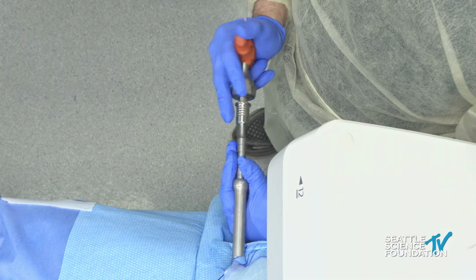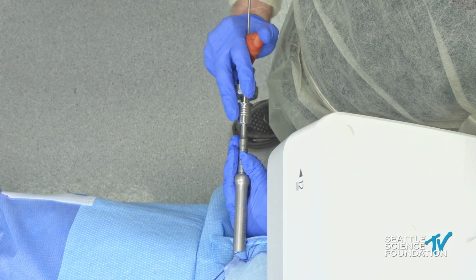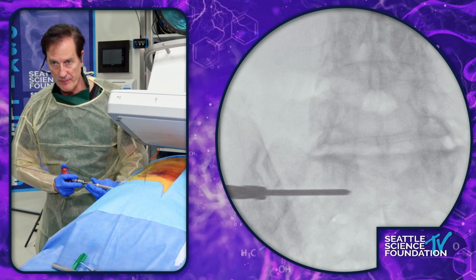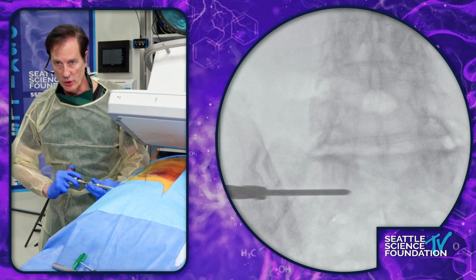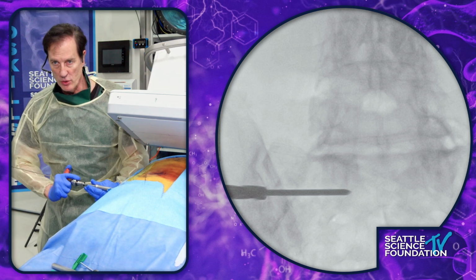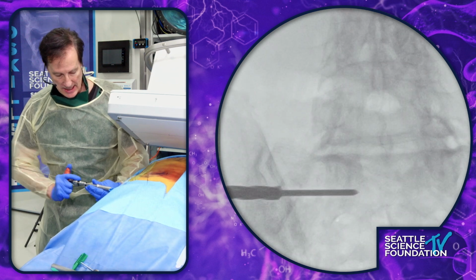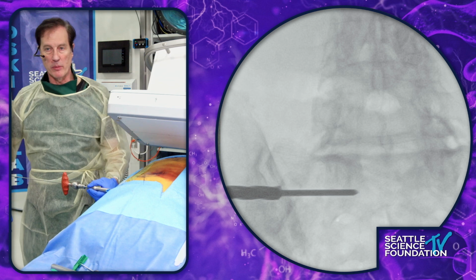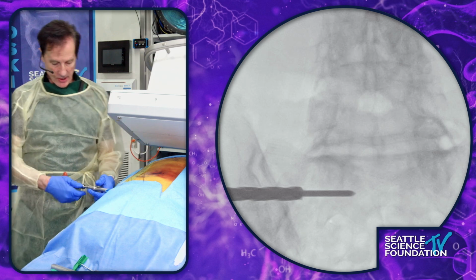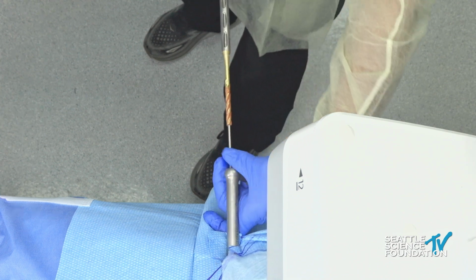So we see the drill coming in, and just like most of the time, even when the body is osteoporotic, the SI joints, especially in the scenario of SI joint dysfunction, can be very sclerotic and very hard, and that's good for fusion. So we will cross the SI joint. You can see the drill crossing over the SI joint and into the sacral ala. I can feel it give there, so I know I'm in. Let's take a confirmatory picture for demonstration. And then we'll take the drill out, leaving the Steinmann pin in.